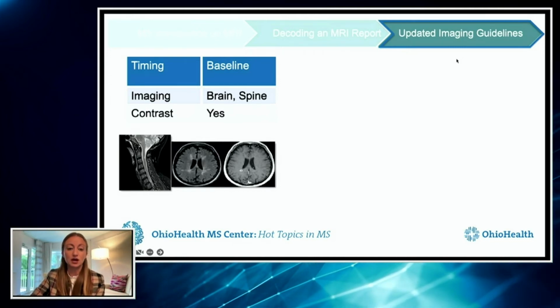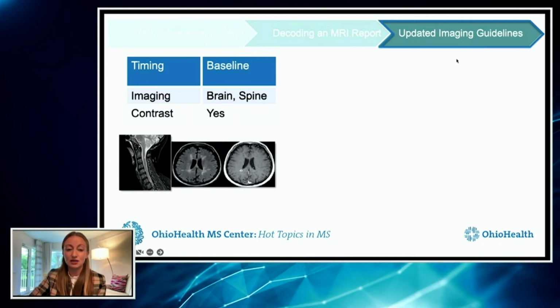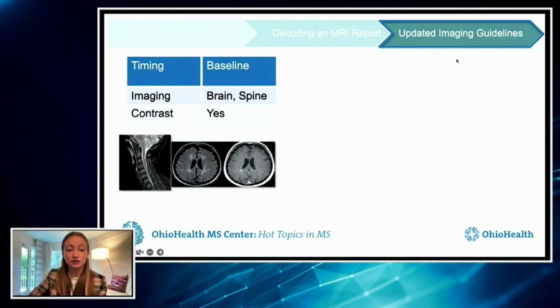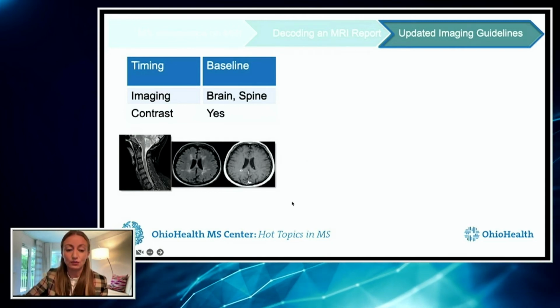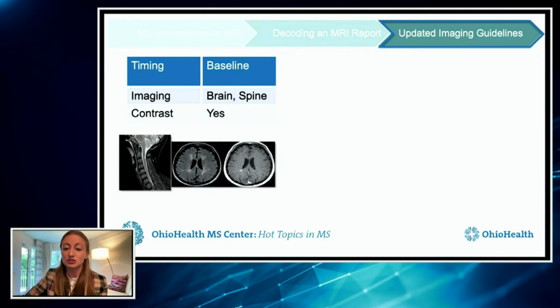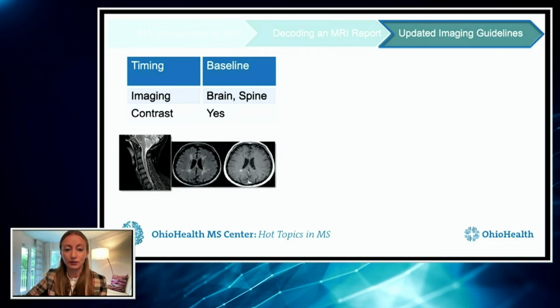because if there are contrast-enhancing lesions as well as non-enhancing lesions, that tells us that there's change in time because there are both active and not active spots. And it also can tell us whether the MS is active at that moment. So if there are a lot of contrast-enhancing lesions, that tells us there's ongoing inflammation and tells us we really need to start treatment quickly.